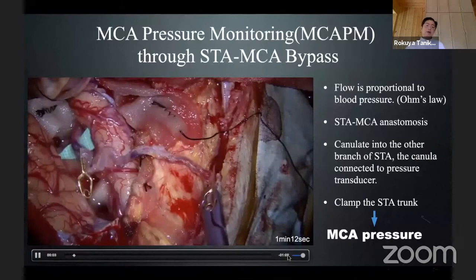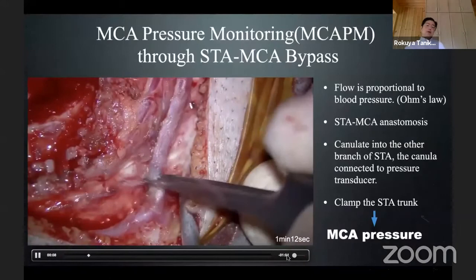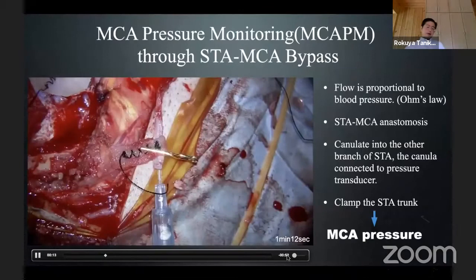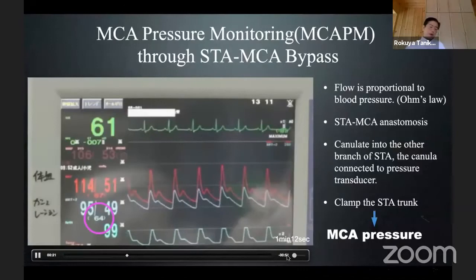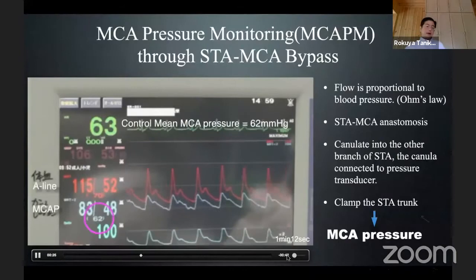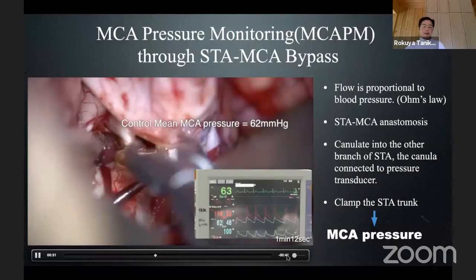This is an example of MCA pressure monitoring through an STA-MCA bypass. One of the STA branches is cannulated, connecting to a pressure transducer. By clamping the STA trunk, you can monitor the MCA pressure. MCA pressure is 62 mmHg mean pressure.